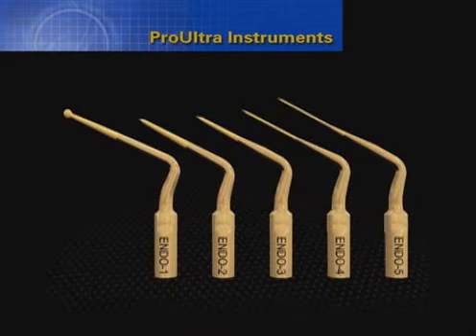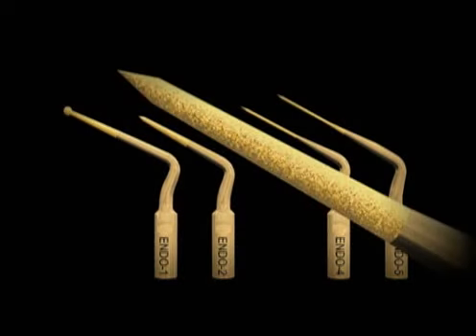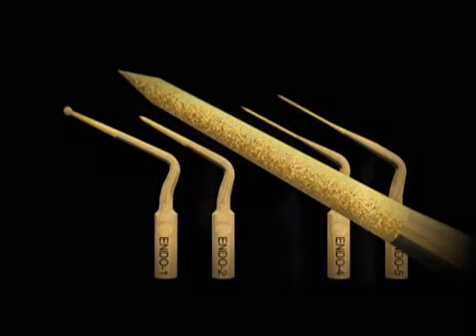The Pro Ultra Endo 1 through 5 tips are made of stainless steel and then externally coated with a zirconium nitride abrasive. These ultrasonic instruments can be introduced into small spaces while enhancing vision, improving performance, and expanding clinical possibility. The zirconium nitride coating enhances durability and enables the instruments to sand away materials during endodontic treatment and disassembly procedures.